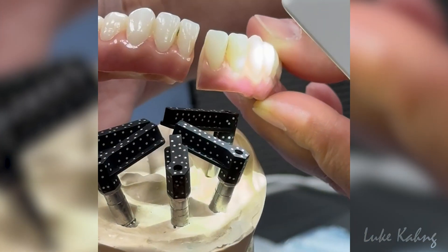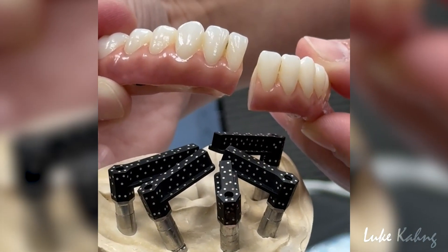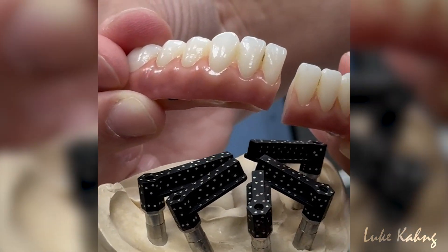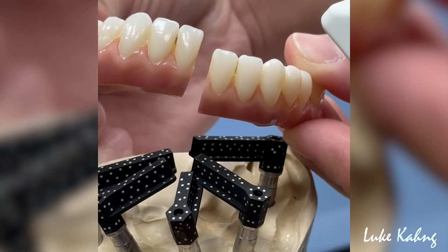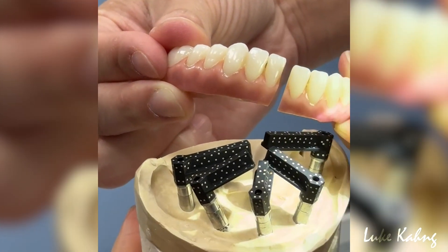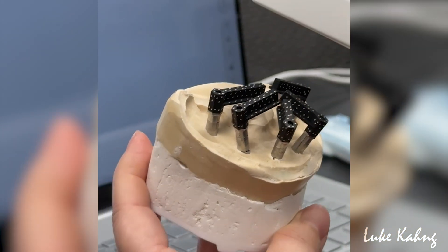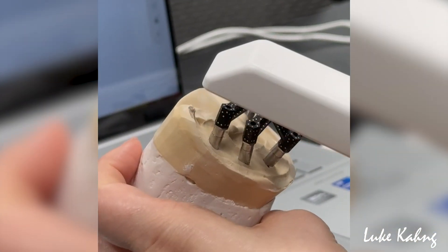This is the example for the pontic placement. It's a problem and we're using the Shining 3D scanner. We scan to make sure it's done the same way. Do your zigzag, initiate it, press your button.